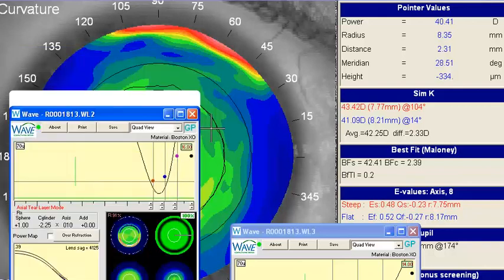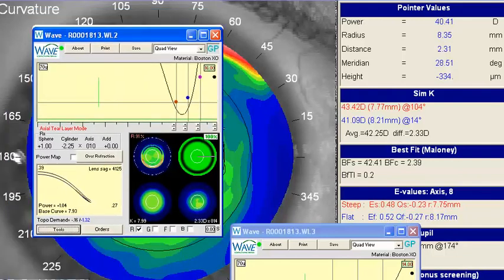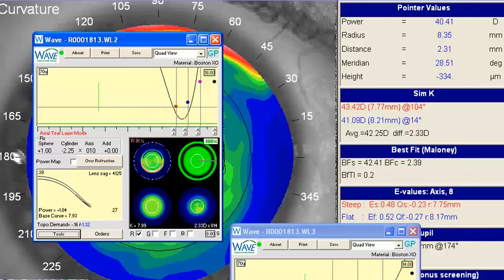Now let's look at the design for a moment. The design actually looks quite good. The fact that you're getting some scleral compression out there suggests that it's just too tight. The best thing to do, if you can, is loosen this lens up, flatten it up. If you go with a flatter base curve, it should loosen up that outer zone. And even though your edge angles look pretty good, a flatter lens will create a little bit better tear exchange on the outside, and therefore you won't have so much limbal compression.